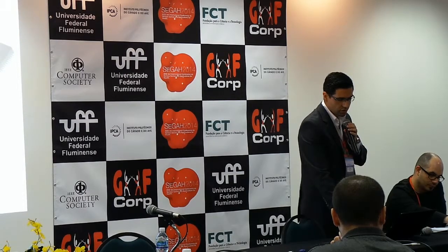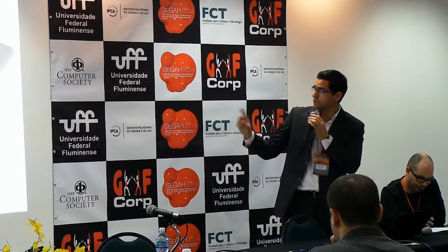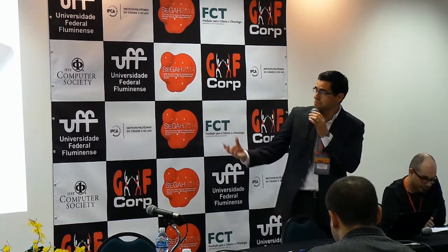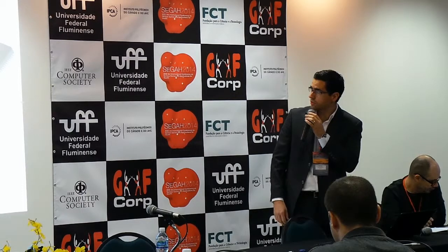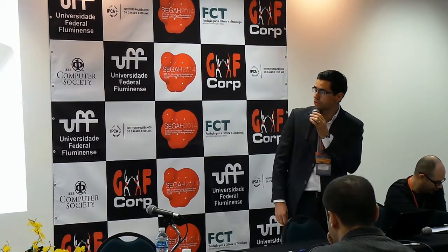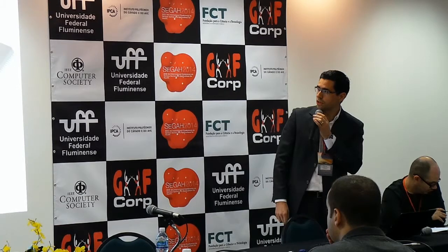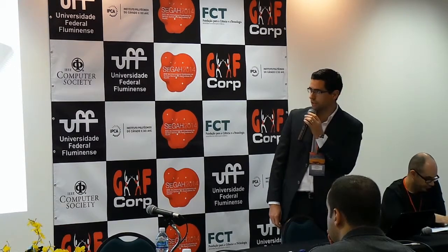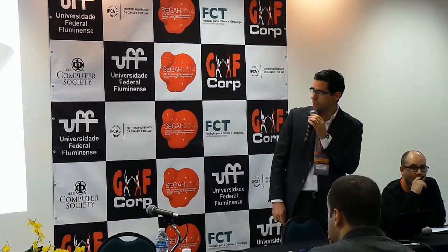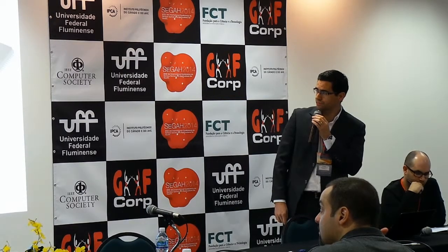The analog to digital conversion is the ADS1299, from Texas Instruments. The main features of this converter are the number of channels, 8 channels, 24 bits resolution, and from 256 samples per second up to 16,000 samples per second. It is very low power and it has very low noise.